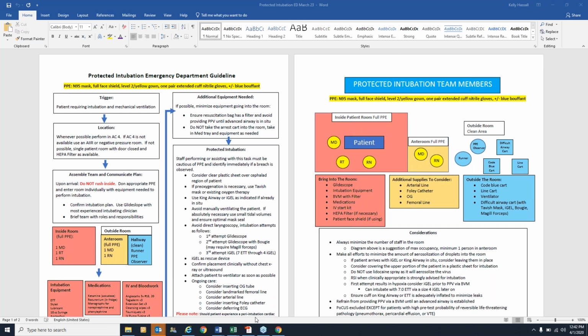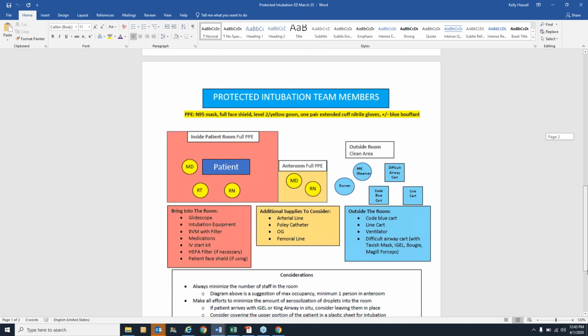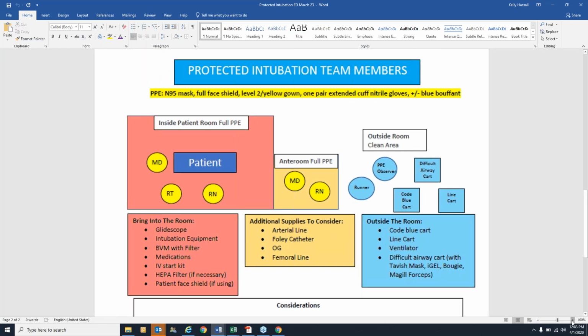Our anesthesia colleague said that you do need 2 modes of confirmation. So we were doing direct visualization with video laryngoscopy, but we did add a colorimetric end tidal CO2 detector. Our observation was, because we are adding a filter between the inline and the end tidal, post-intubation, where we bag the patients for confirmation, the colorimetric end tidal detector takes a couple of breaths, maybe as many as 3 or 4 breaths. So you've seen the ETT go through under direct visualization, but just don't panic and wait for the CO2 to get through the filter for the colorimetric change.